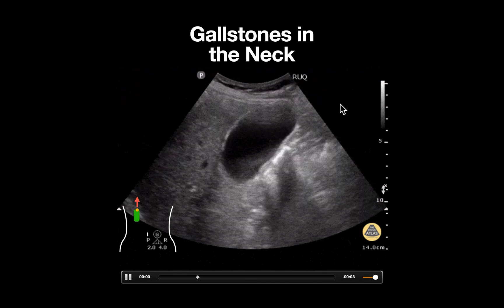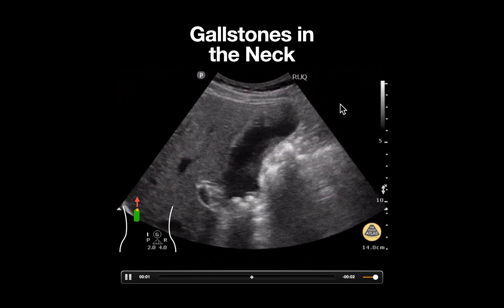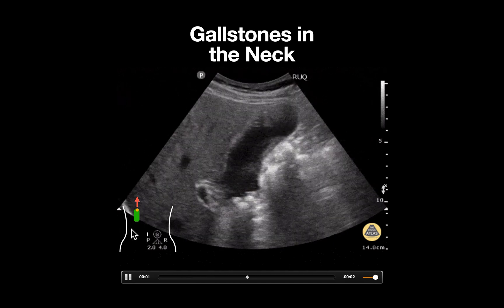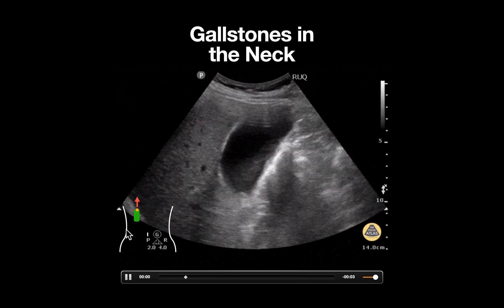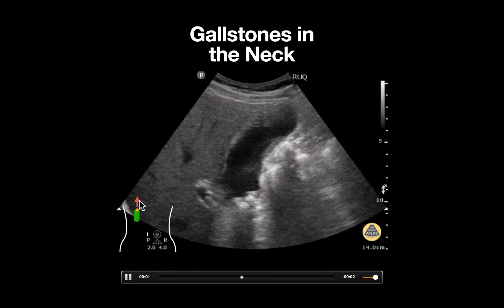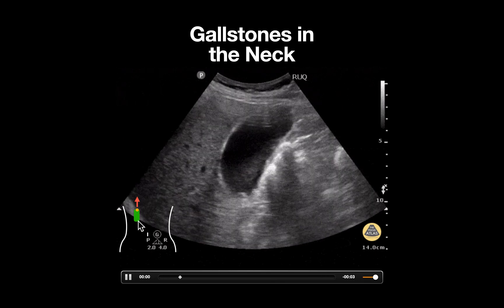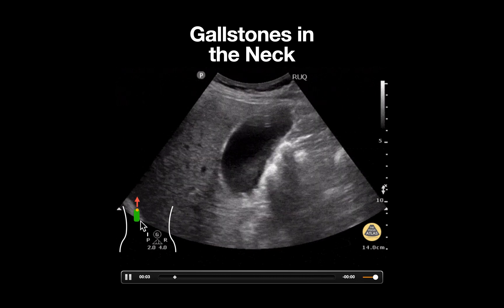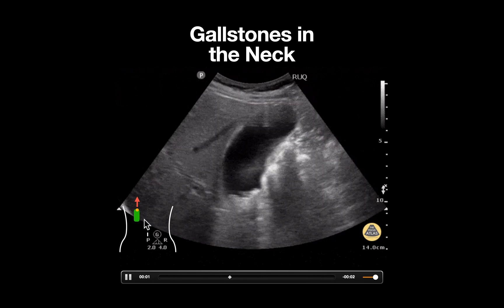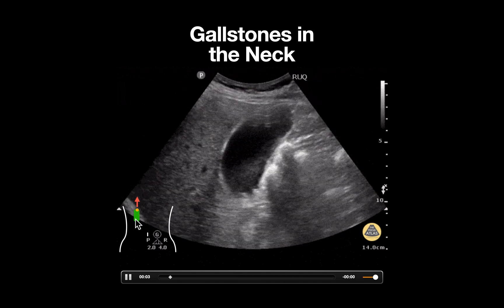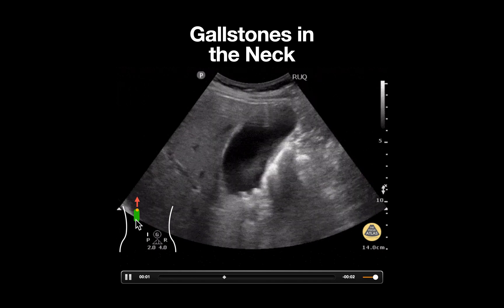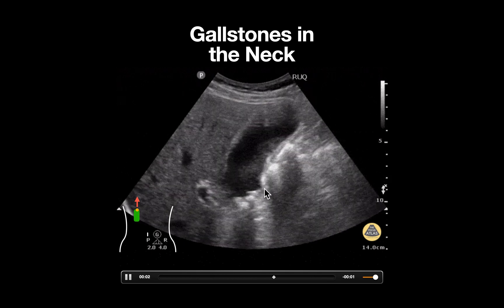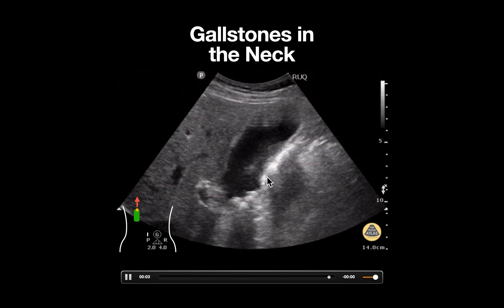To obtain this view, I like to start by placing the probe in a sagittal orientation along the right costal margin with the probe marker pointed towards the patient's head. A good place to start is around 7 centimeters to the right of the patient's midline, also known as X plus 7. The probe can then be slowly slid laterally until the gallbladder comes into view.